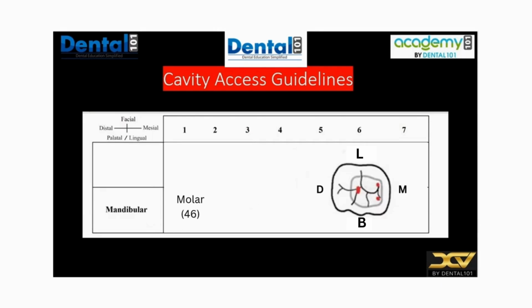The next task that was presented was the 4-6. And we know that the 4-6 has three canals, two on the mesial and one on the distal. So based on that, this will be the shape of your access cavity.